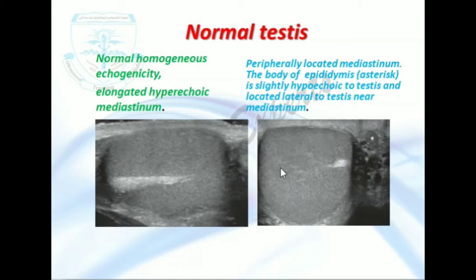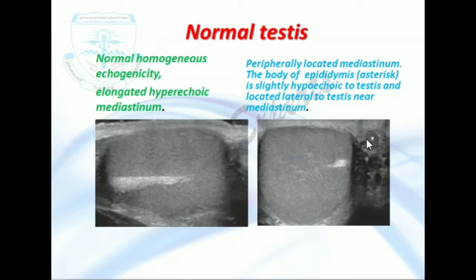This is the normal testis. This is the mediastinum, with hyperechoic echogenicity and a smooth surface. This is also the mediastinum, peripherally located. Here we can see the epididymal body, and if we compare the two, the echogenicity of the epididymal body is lesser as compared with the testes.